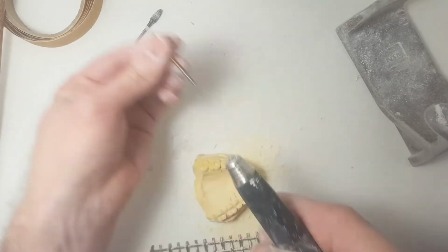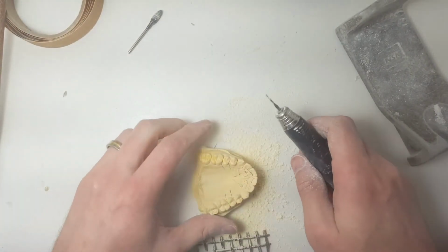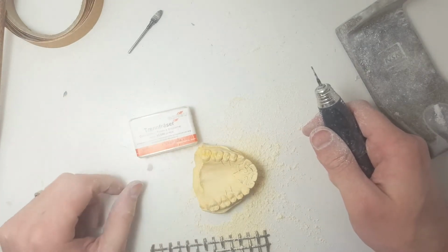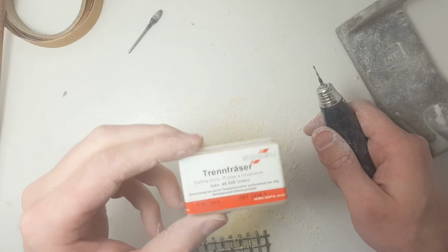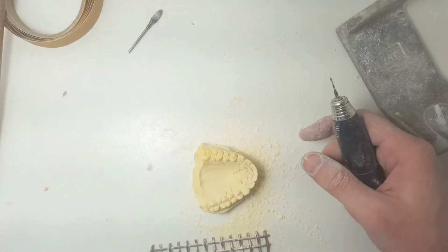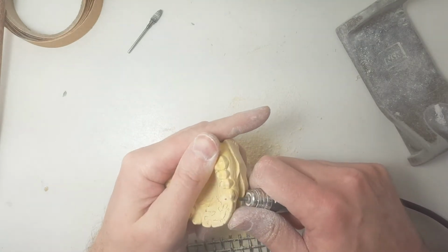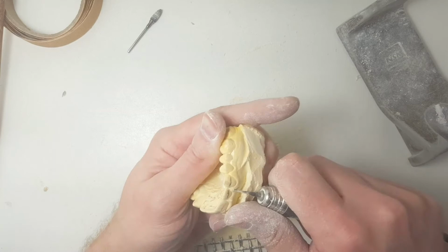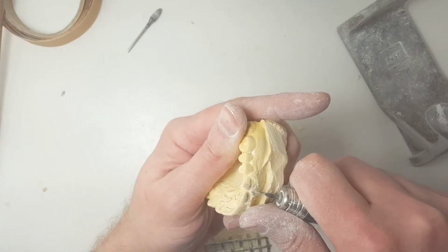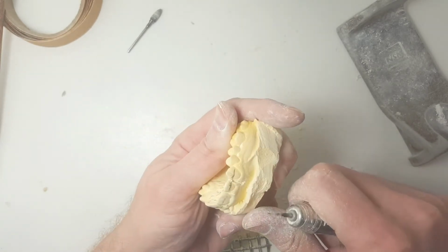So then I'm going to get my cutting burr here. I get these from Great Lakes, package of 6. I think there are no American markings. They're just cutting burrs. Again, for those who are just now tuning in, I just barely cut the teeth, the tissue part only.